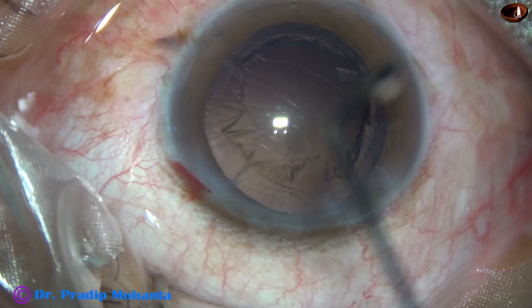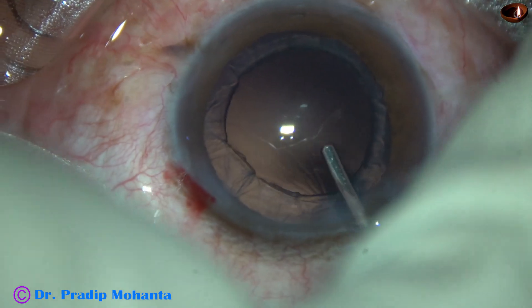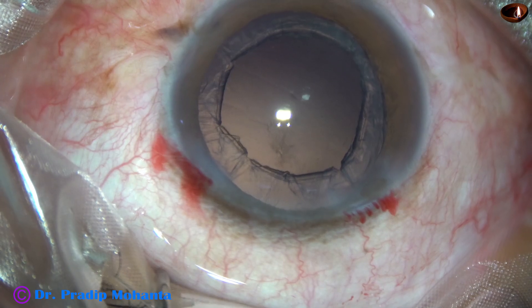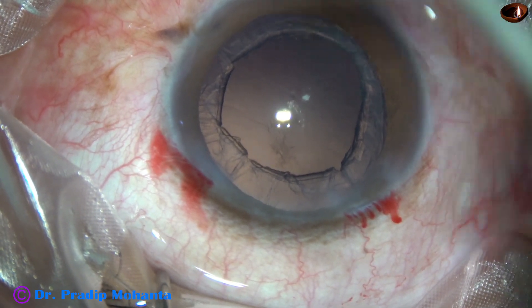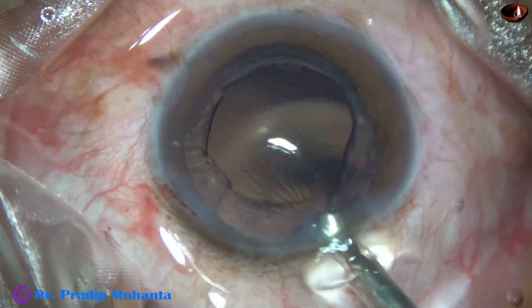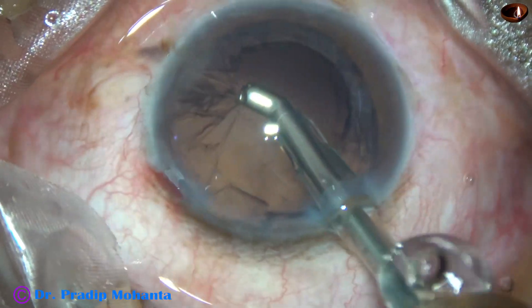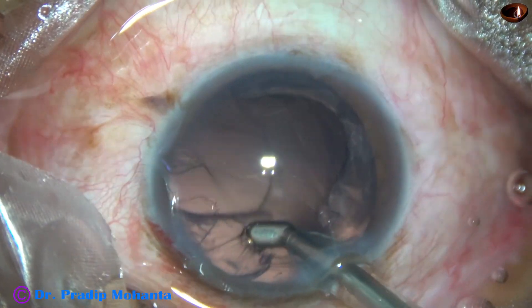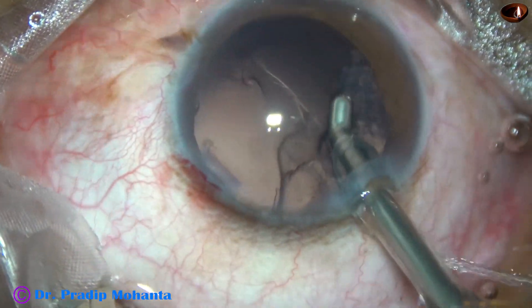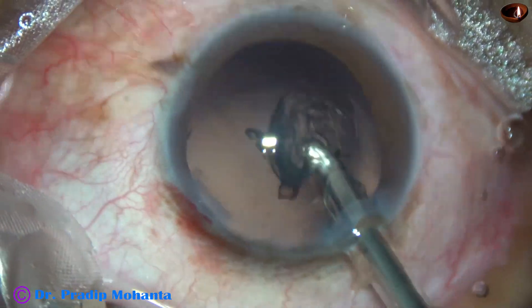Now I have to remove the cortex. It is being done with the help of a coaxial IA from Oatly and the vacuum is 300 and flow rate is 30. I start aspirating the cortex from around 3 o'clock, then from 2 o'clock, then from 6 o'clock, 8 o'clock, 9 o'clock and then the sub-incisional cortex.